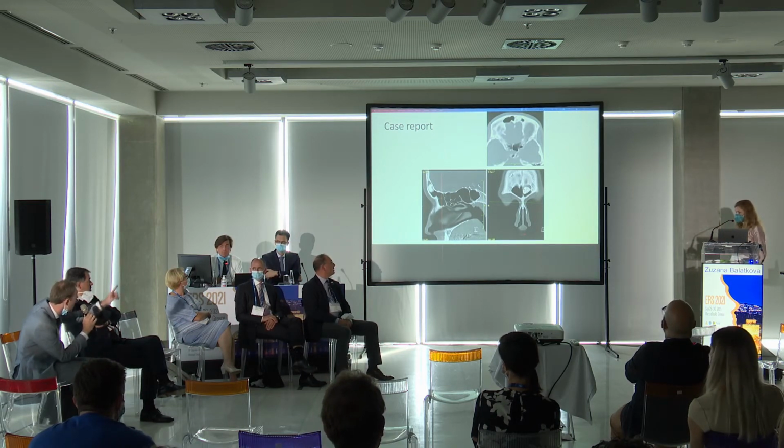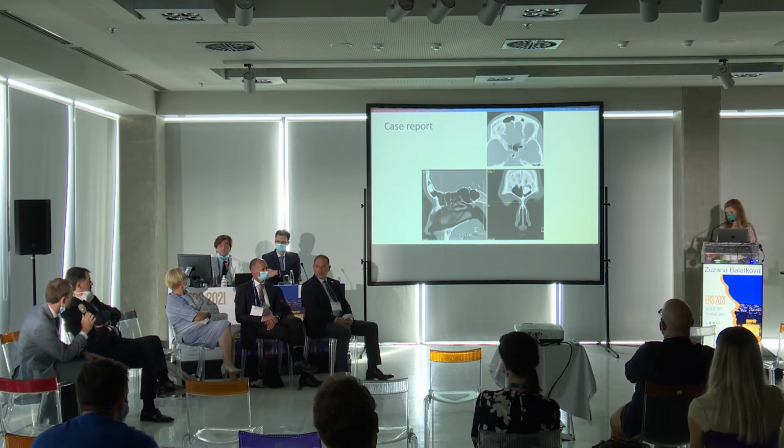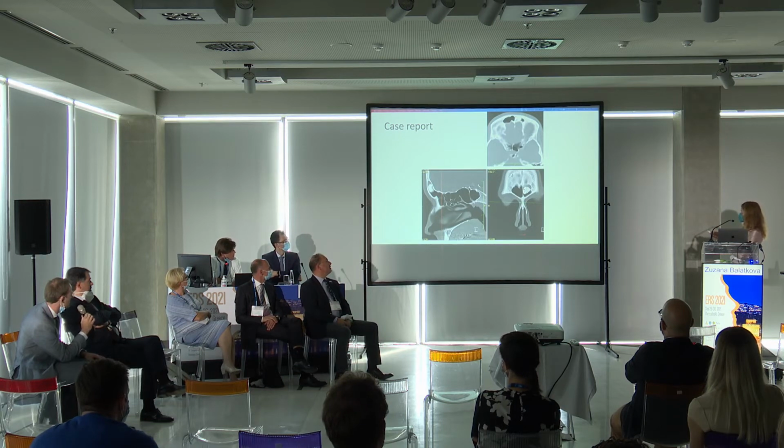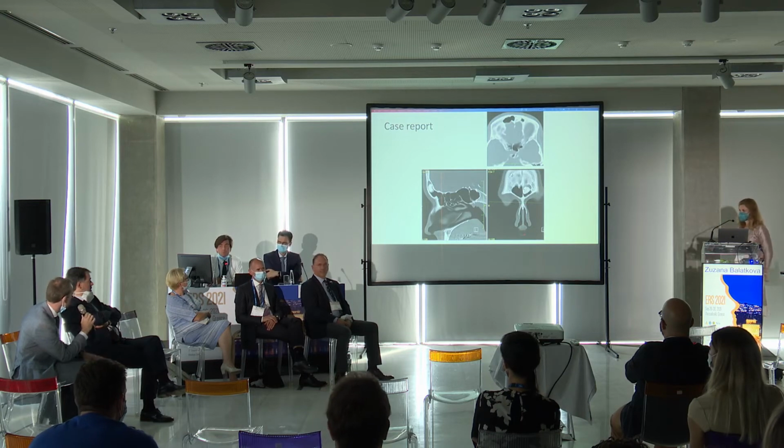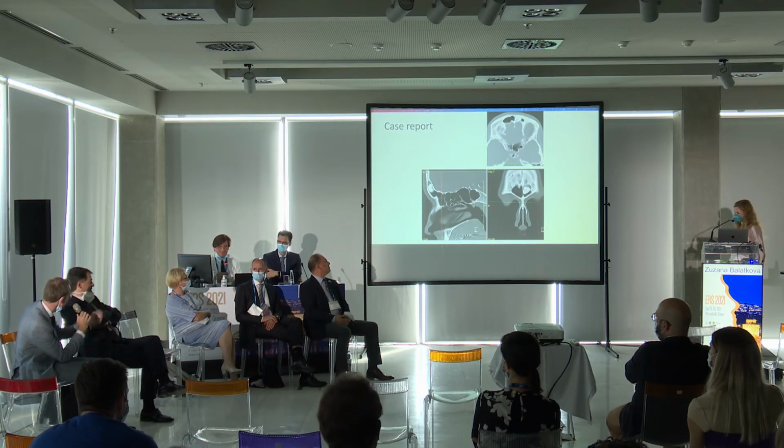But at least if I looked at this scan, I sort of guessed that it wouldn't be on the frontal wall of the frontal sinus, if any, on the posterior wall of the frontal sinus. It was at the border of the medial and posterior. Yeah, and then that makes it feasible. The hard part is if it gets released, and you have this floating marble, which you're trying to get out, and you cannot grab. It's loose, but the opening is small, and you need to cut it in two somehow.